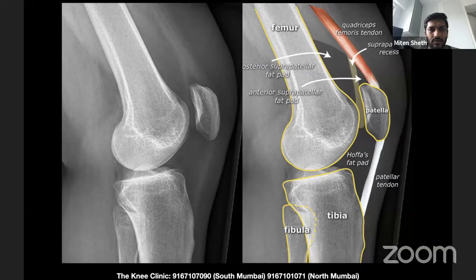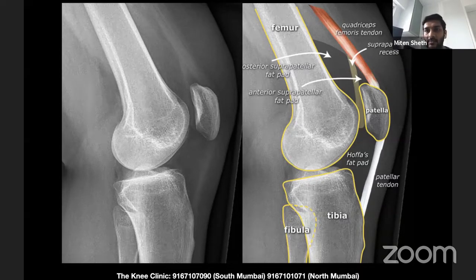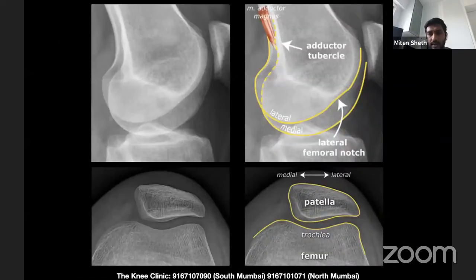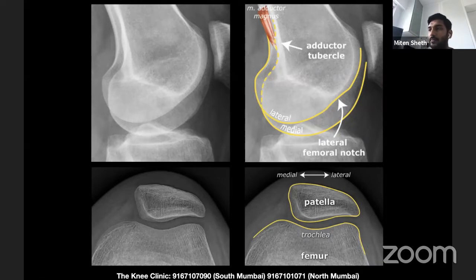We also look at subtle soft tissue shadows. On the right-hand side image you can see the difference between the anterior and posterior suprapatellar fat pads. On the X-ray on the left, there's a thin hyperintense shadow on the superior aspect of the patella — that's joint fluid, minimal at two to five cc in normal knees. This space anterior to the femur fills up if there's fluid in the knee. The skyline view gives us the nature of the patellofemoral joint, which requires its own detailed discussion.